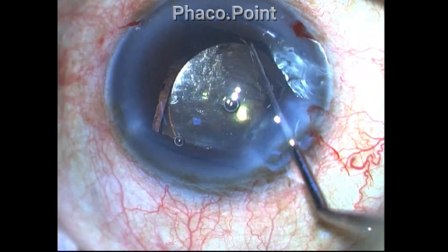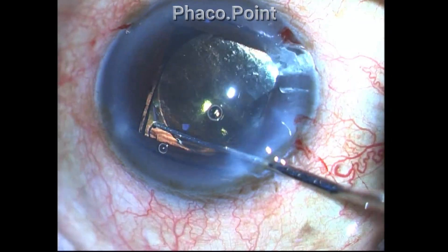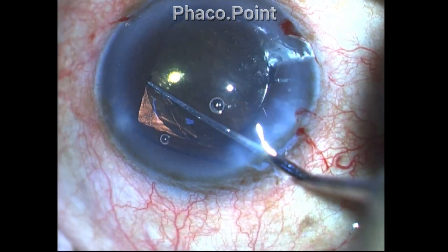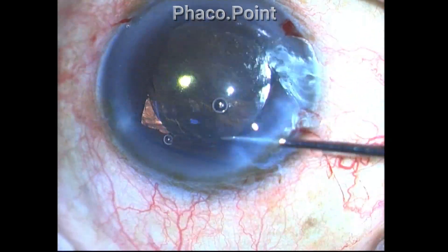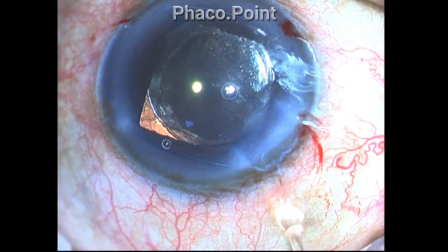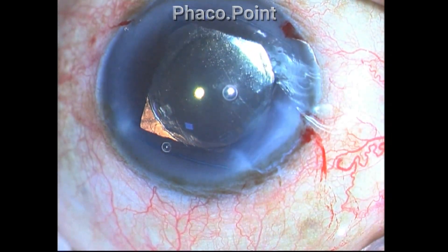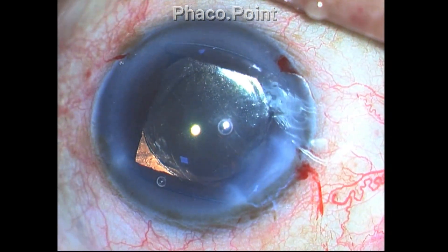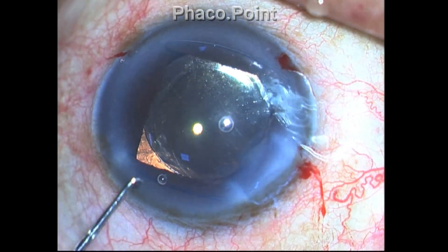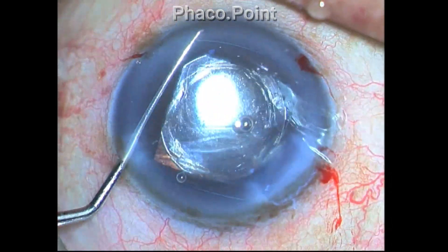That particular haptic is in the bag, so all I had to do was dial the other haptic inside the capsular bag, and the lens got beautifully centered within the capsular bag. Once having achieved good centration of the lens, the next step is to remove the pupil dilating device — let's observe how this is done.